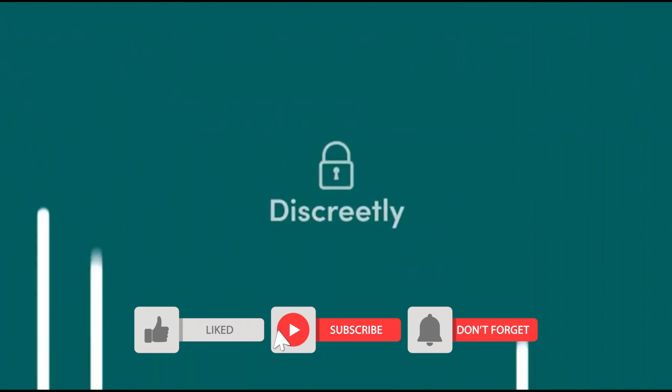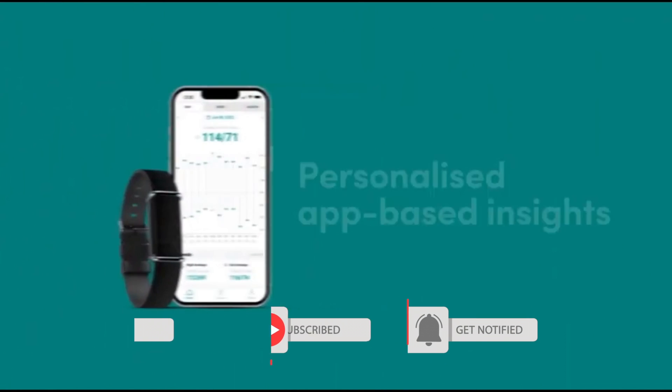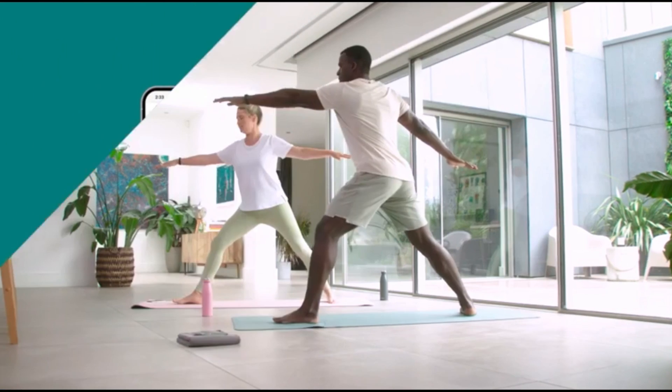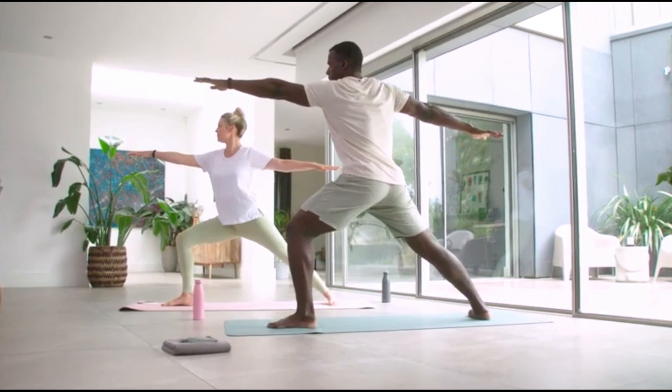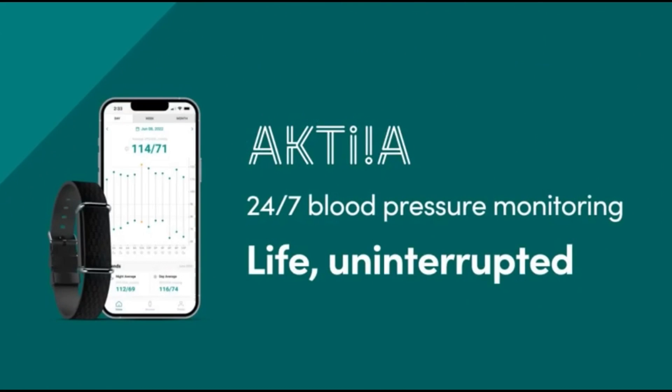I think the issues I have with the Aktiia blood pressure monitor are quite a few, but I would discuss that later when I probably do a one or two week review of having used this particular blood pressure monitor.